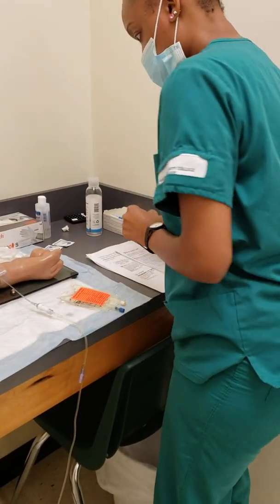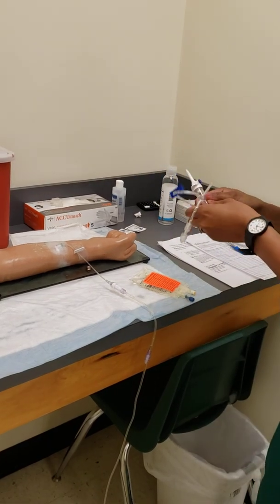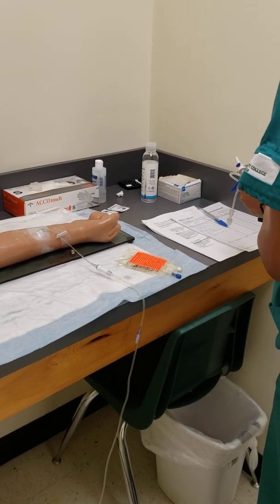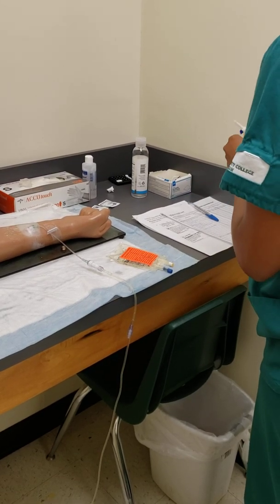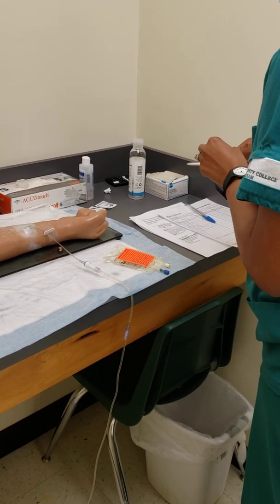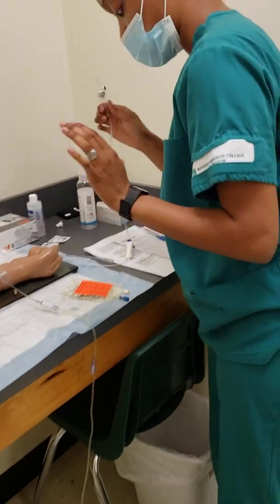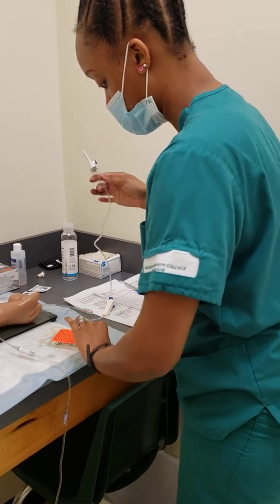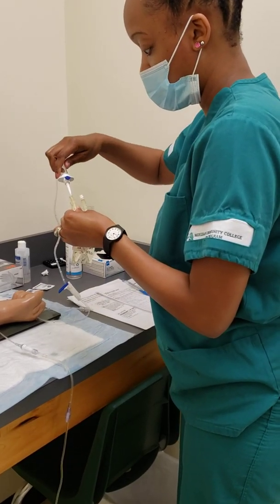Okay. All right, and now I'm going to go ahead and spike my bag. I'm going to make sure I prime it down first. And I actually don't have a cap on here because I've already taken it off. So I would make sure I get a new pack that has the cap in it, and I will remove my cap because I have contaminated it since it's touched the line. So I will remove my cap and remove this, and we're going to spike the bag.